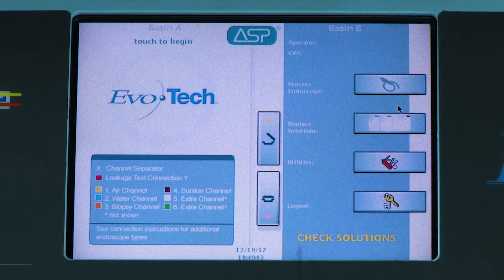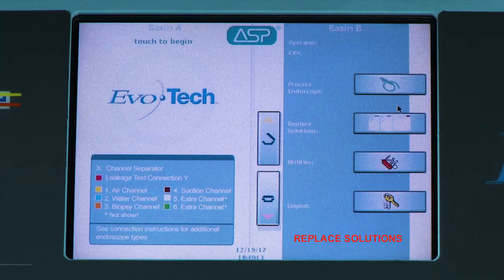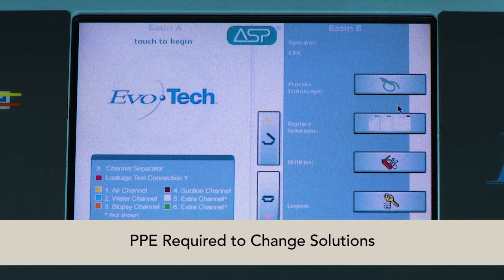The system will indicate on the screen when any of the chemicals are low or empty with a yellow warning. This warning will occur when there are approximately 6 cycles left in the bottle. A red screen indicates that a bottle is empty and will no longer run a cycle until the EVOTECH solutions have been replaced. PPE is required, and both basins must be idle to change solutions.